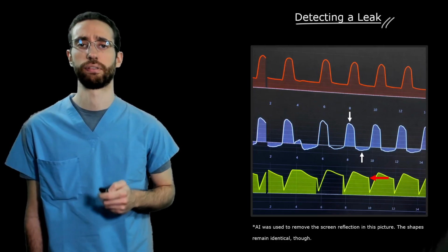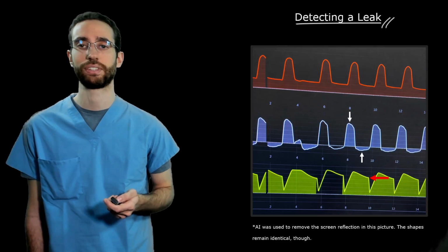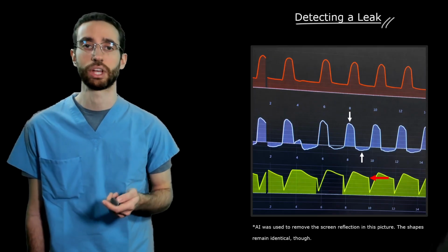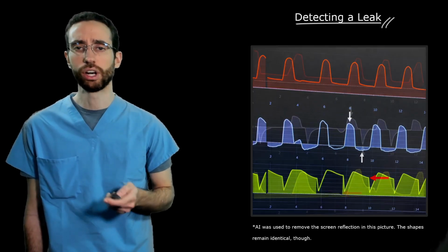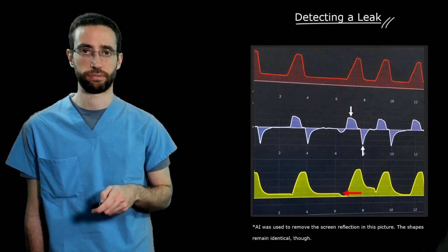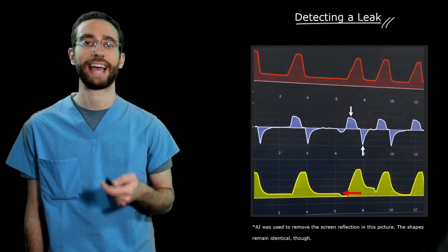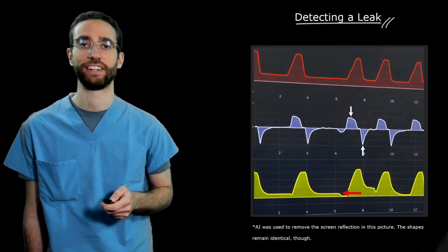The area under the curve of the flow time graph equals tidal volumes. So this discrepancy is just another sign that inspiratory or delivered volumes are larger than returned or expiratory volumes. Look how once we intentionally advance the endotracheal tube to the left mainstem bronchus, bypassing the fistula, the area under the curve between the inspiratory and expiratory portions of the flow time waveform are more similar to each other.